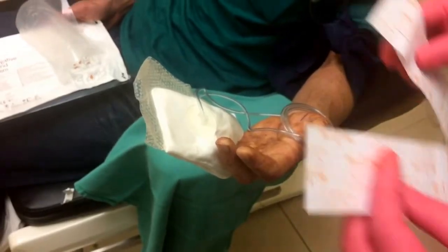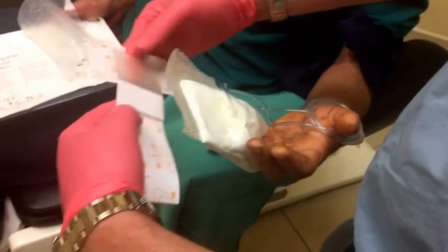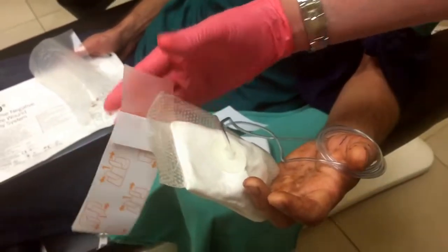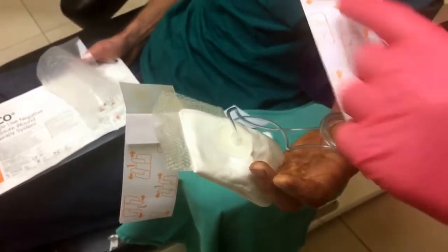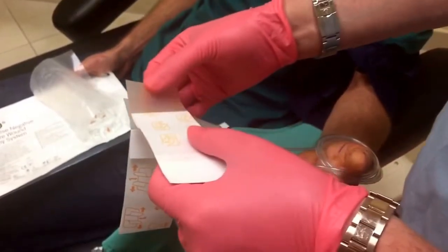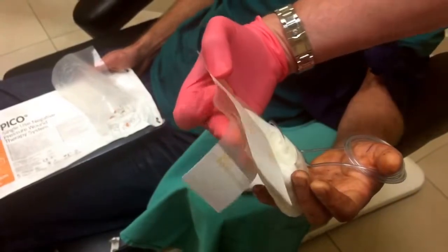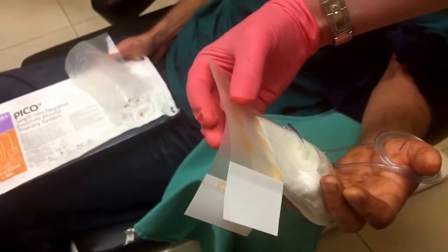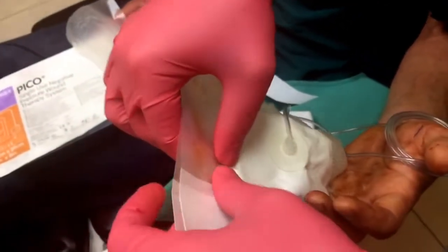The last step is when we have to sandwich it. So what you do is go like this — you want to have like about 50% overlap. So there's a one and a two. You take the two ones off and then you put them together. Again, it's like 50% overlap. And what I do is when I pinch them together, we're getting a nice seal.